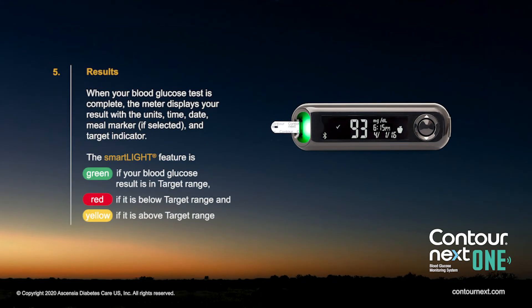When the test is complete, the meter displays your results with the units, time, date, meal marker if selected, and target indicator. The smart light feature is green for in target, red for below target, and yellow for above target.